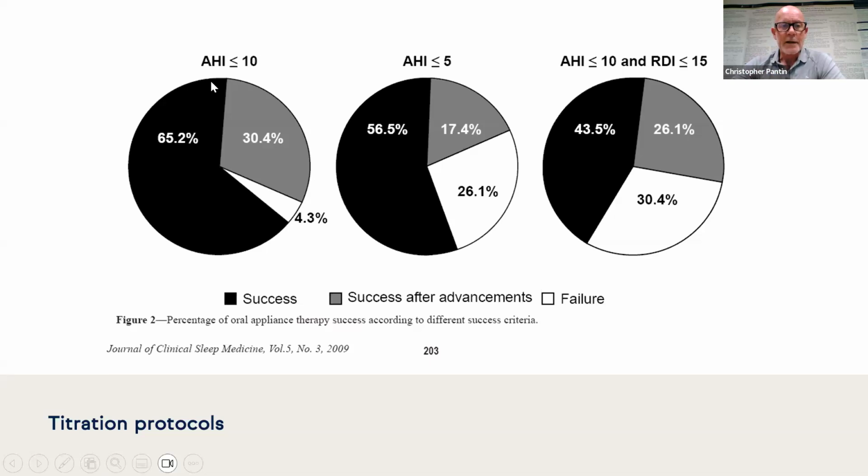Anyway, the good news was that they got pretty much a 95% success rate when you consider the success before the sleep study and the result of the titration during the study, and only about 4.3% didn't respond at all.